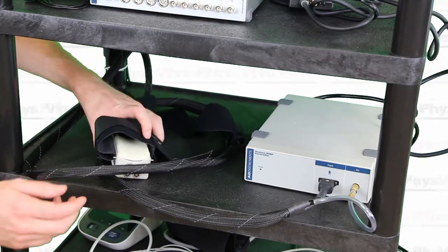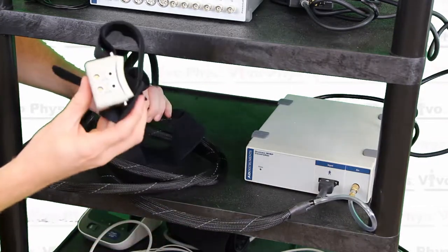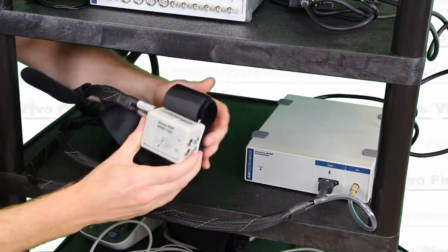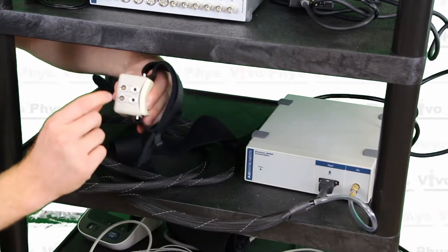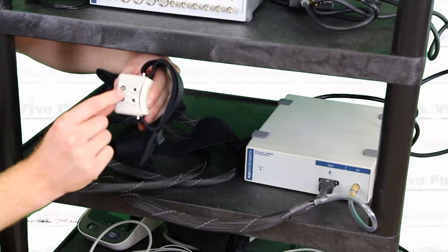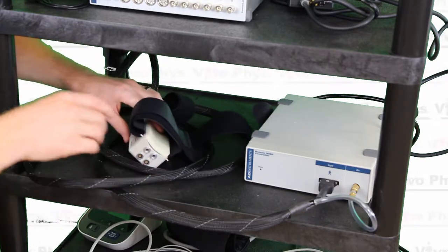Both of those connections go to the wrist unit for this device. The wrist unit is placed on the arm at the level of the wrist, and there will be at least one finger cuff attached to the front of it — that's how we actually get the blood pressure.